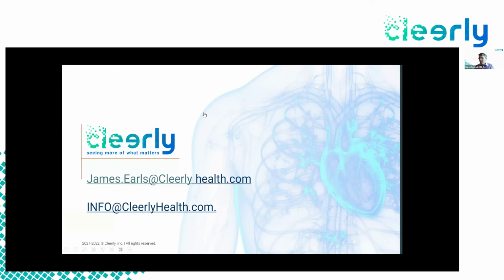So for the purpose of general practice, I would say it seems from the available data that both of these tests provide a clinical answer, which is: is it likely that this vessel has ischemia? And many patients still will need invasive evaluation. At the end of the day, patients go to the cath lab, and whether the non-invasive FFR or QCT ischemia is positive or negative, you can get a contradictory result in the cath lab. It's still possible. The tests are not perfect.